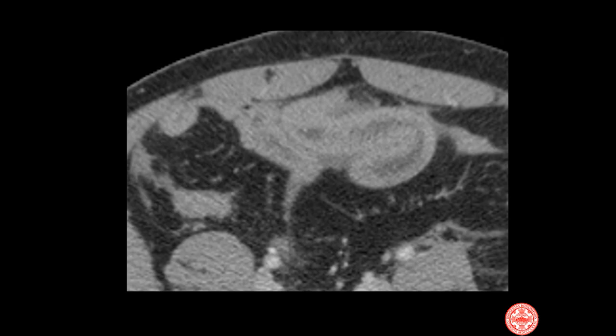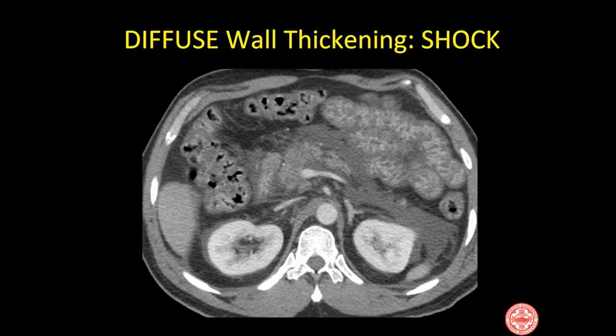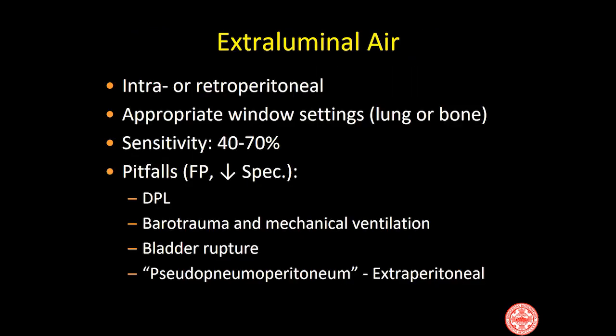Another patient with similar findings of bowel wall thickening and stranding in the mesentery. On the other hand, this is not bowel trauma — notice the diffuse thickening and hyperenhancement in the wall of these loops of jejunum with fluid in the third spaces, intraperitoneal and retroperitoneal: typical appearance of shock bowel in someone who had absolutely no sign of bowel trauma but had hypovolemic shock from lower extremity fractures.